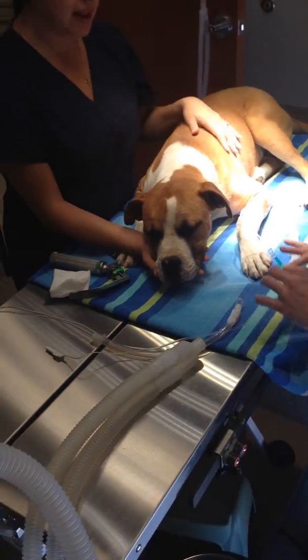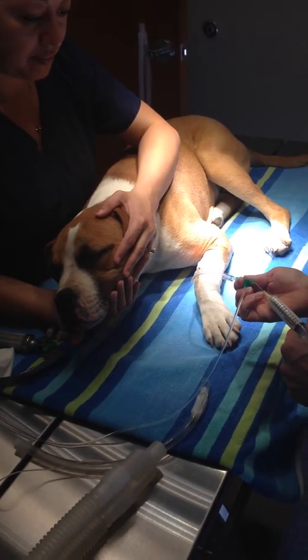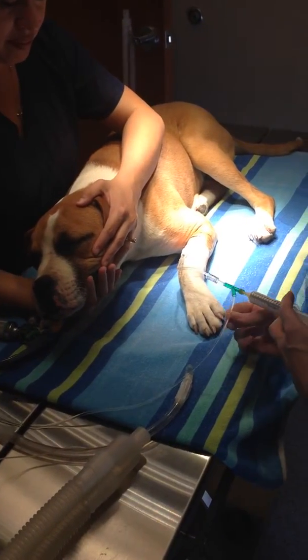Ready for our propofol. Anna's gonna check for jaw tone to see when he's ready.